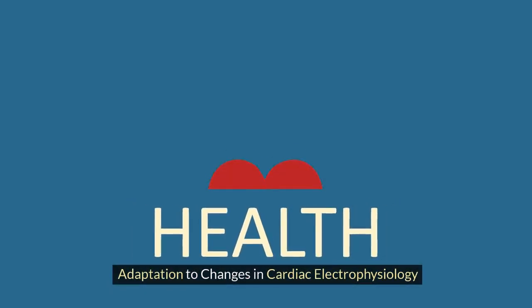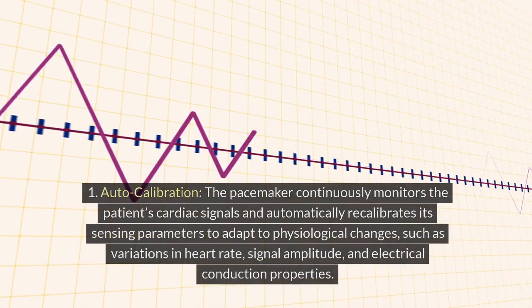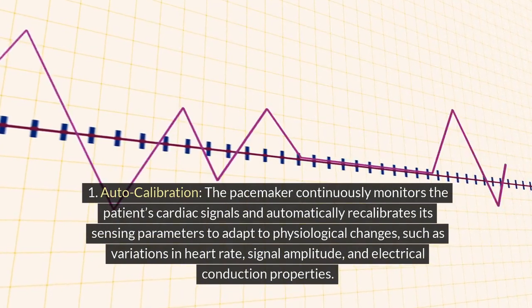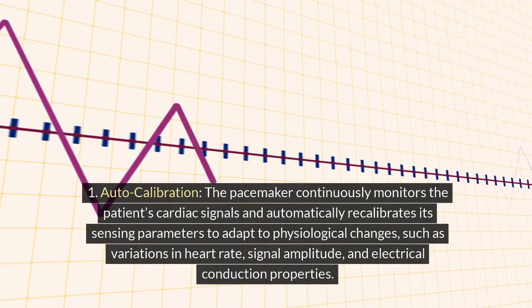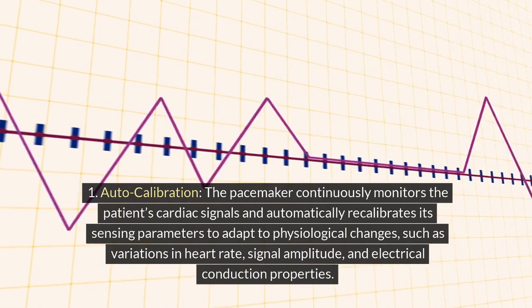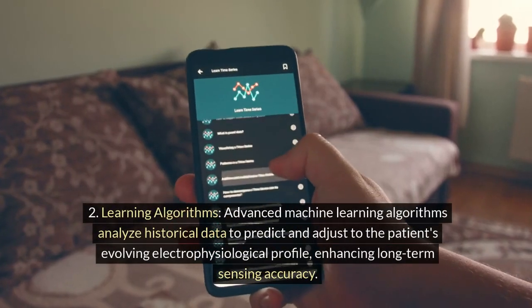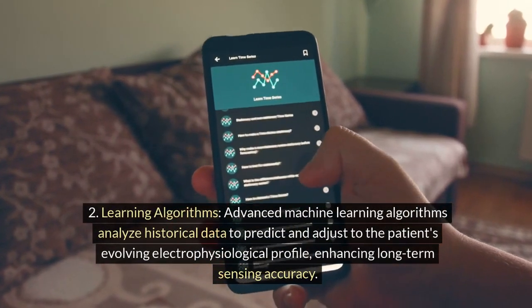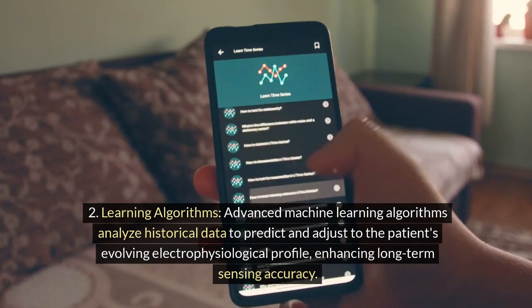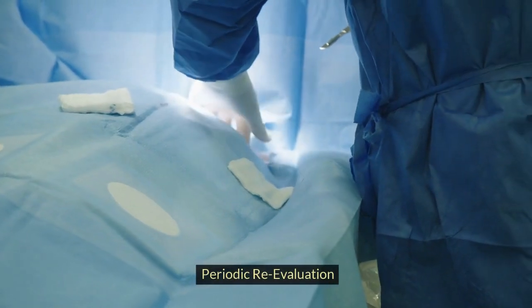Adaptation to changes in cardiac electrophysiology. Continuous learning and adaptation. 1. Auto-calibration. The pacemaker continuously monitors the patient's cardiac signals and automatically recalibrates its sensing parameters to adapt to physiological changes, such as variations in heart rate, signal amplitude, and electrical conduction properties. 2. Learning algorithms. Advanced machine learning algorithms analyze historical data to predict and adjust to the patient's evolving electrophysiological profile, enhancing long-term sensing accuracy.